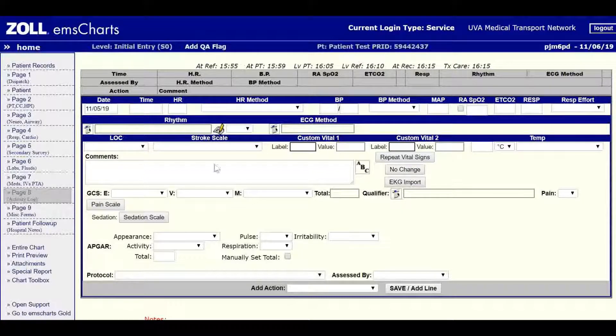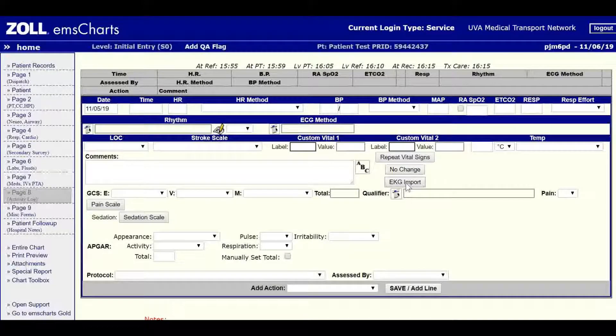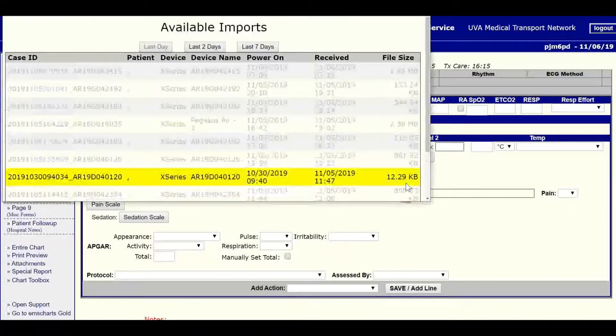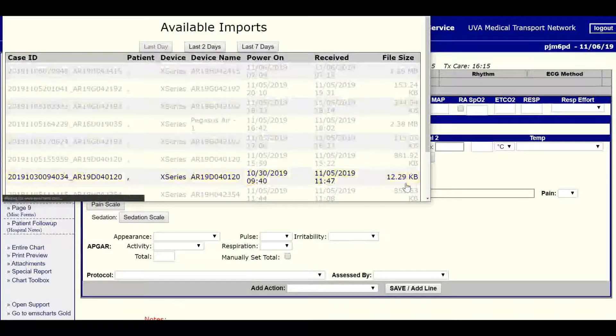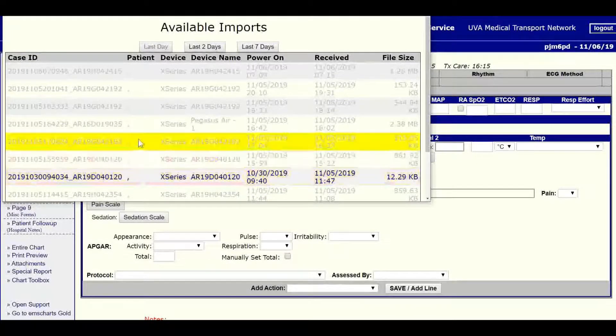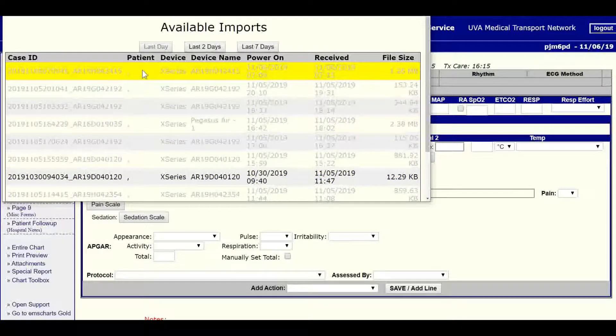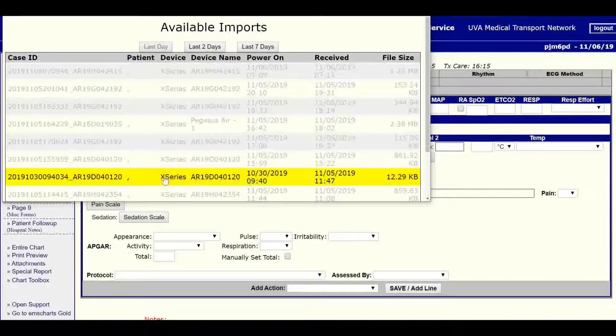Then we're going to come down to the EKG import button. This is what we use to import Zoll data into EMS Charts. When you click it, you'll be presented with a screen with all of the data that's been updated within your agency.